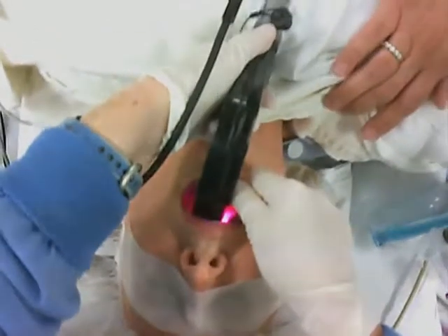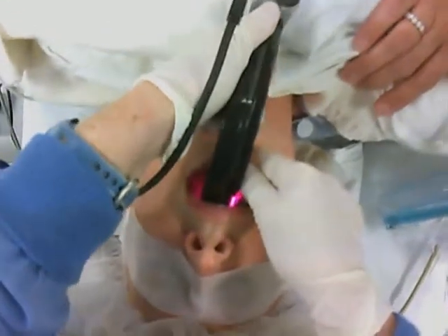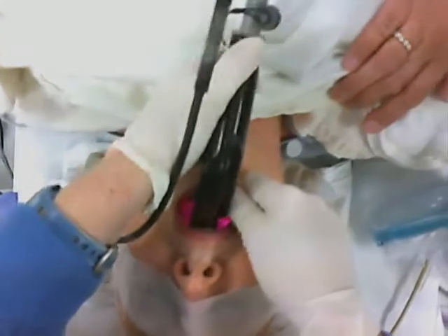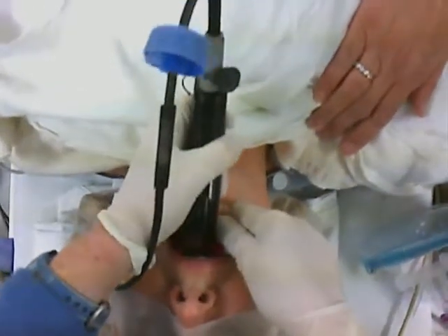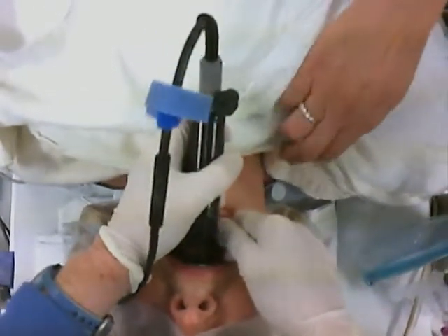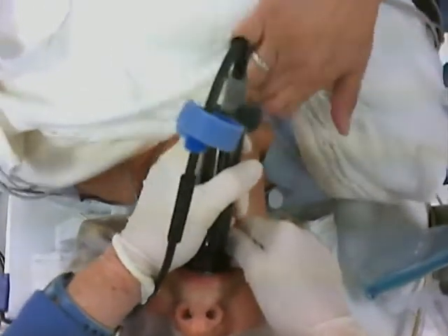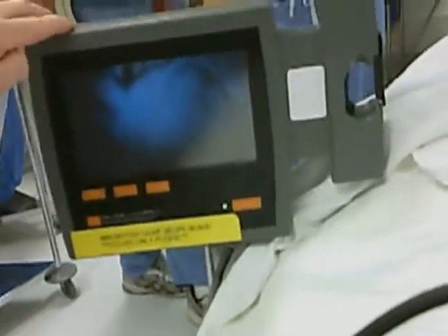Avoid the temptation to look at the monitor until you've placed the blade inside the mouth and turned the corner into the pharynx. Once inside the mouth, optimally position the image of the larynx in the midline.